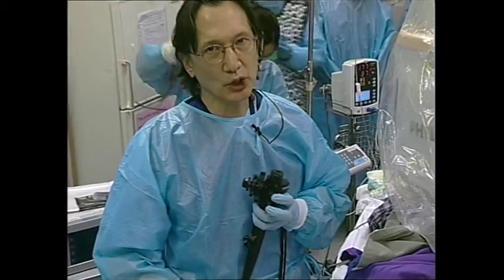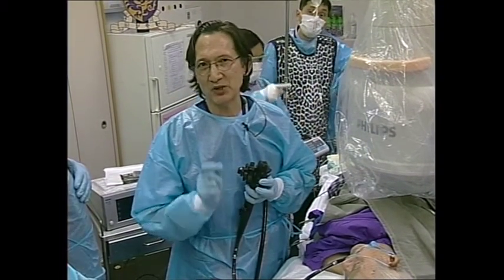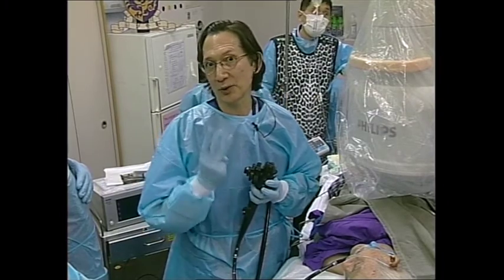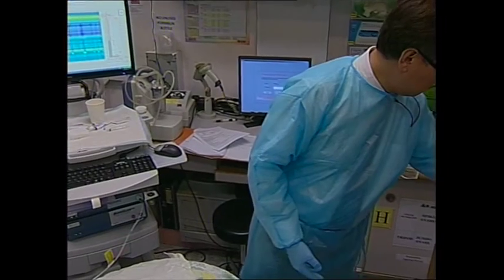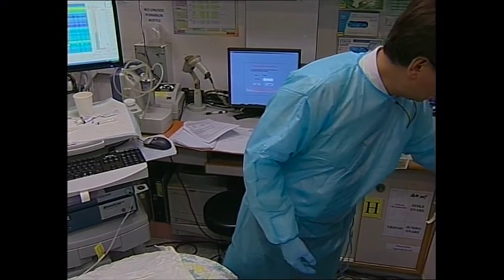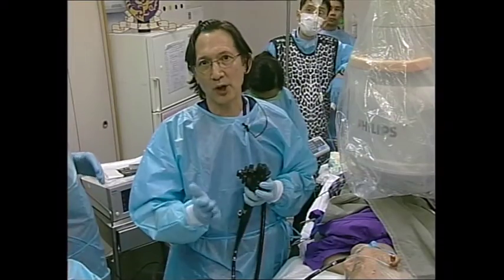Yes, you could. A mature tract will have formed after 1 month. However, our experience from animal studies has been that you need to leave the stent in for 3 months to have a tract that remains open, that is durable. So if you want to have a tract that's not going to close down, you need to leave the stent in for a longer period of time.